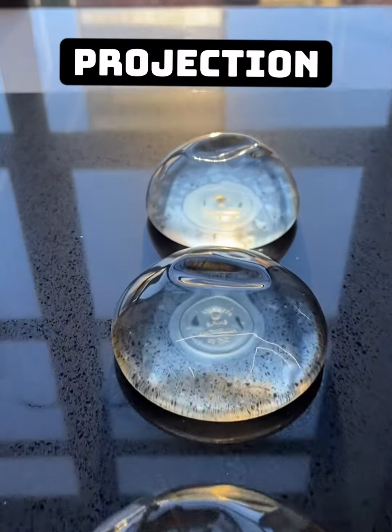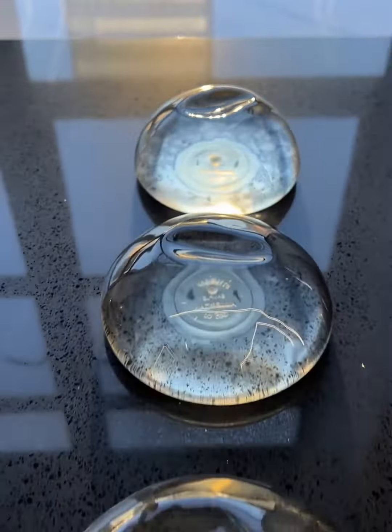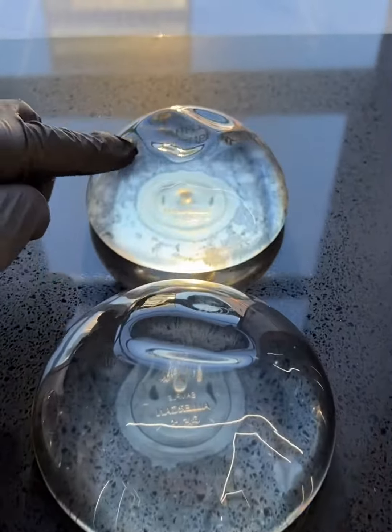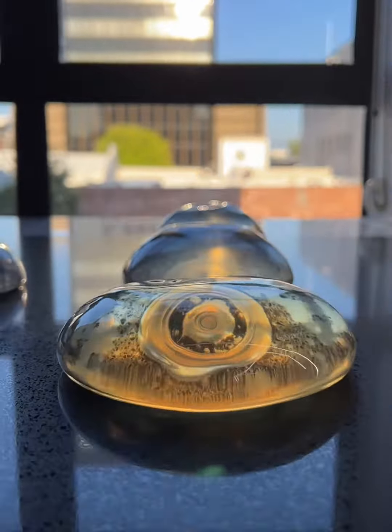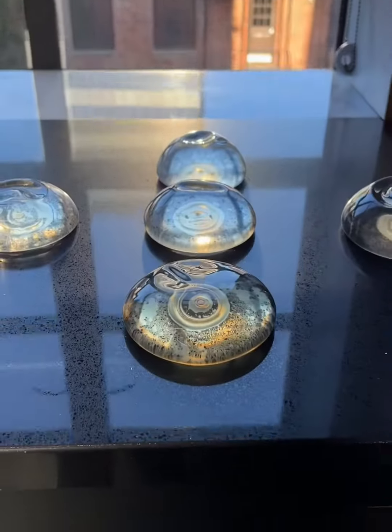Projection refers to how far forward the implant sticks out off the chest relative to its volume. Here we have low, moderate, and high projecting implants, all of the same cc's in volume. Notice how the low projection is the most wide and the high projection is the most narrow.